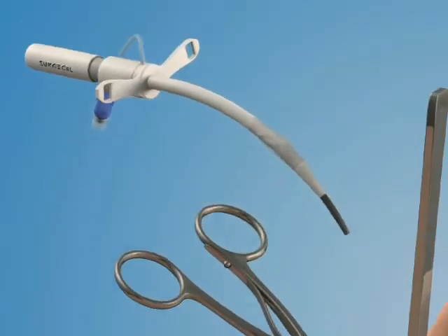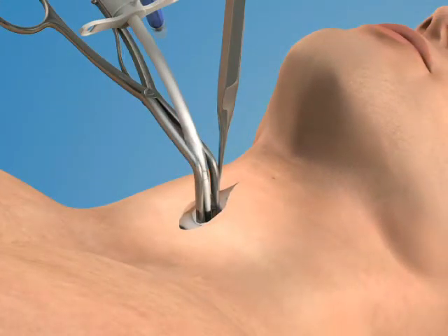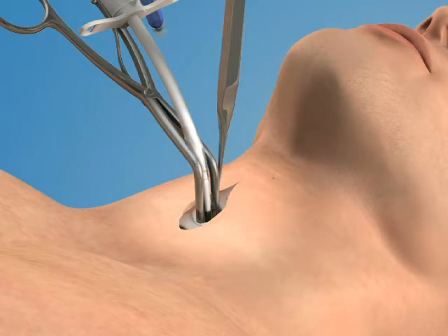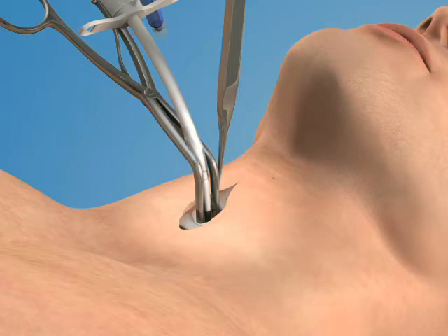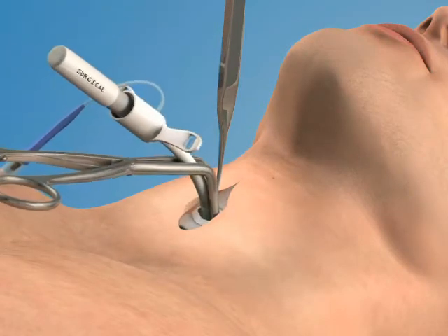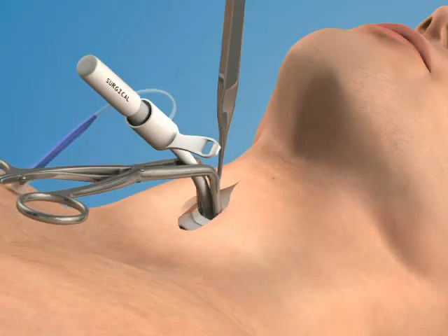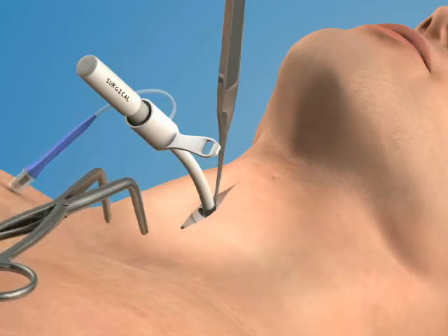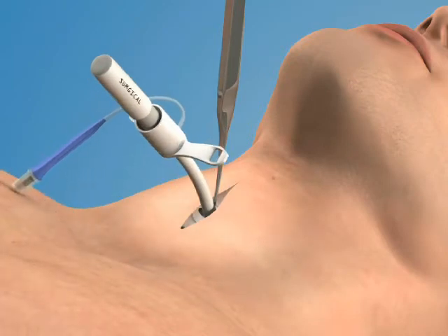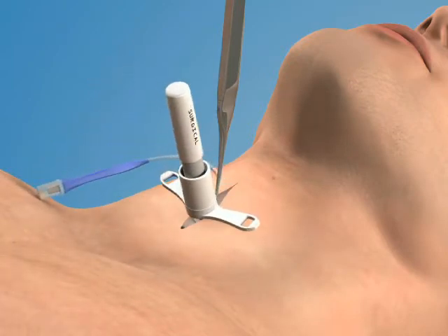Insert the airway into the trachea so that it is oriented in a plane parallel to the trousseau dilator. Then rotate the dilator and the airway together 90 degrees while advancing the tube further into the trachea. Then advance the airway catheter completely so that the flange of the device rests against the patient's neck.